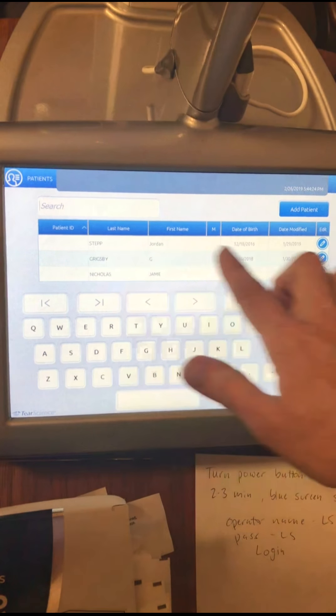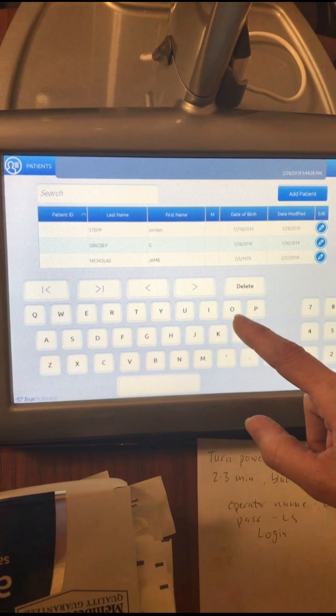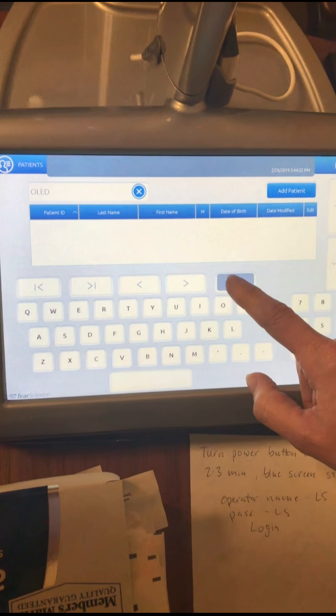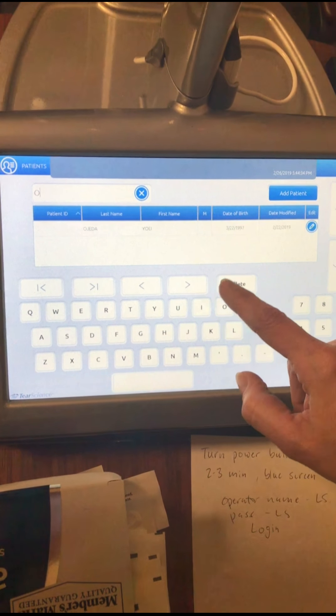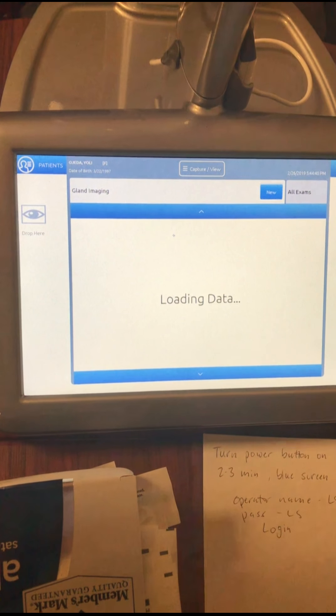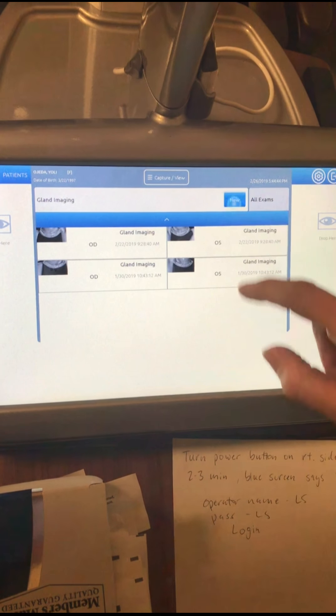Once you hit save you'll see the list of patients here. You find your patient and highlight her. I want to take a new picture so I'm gonna hit new.